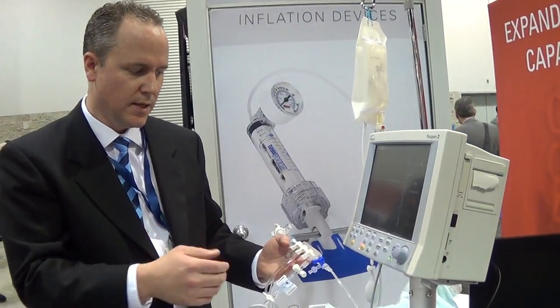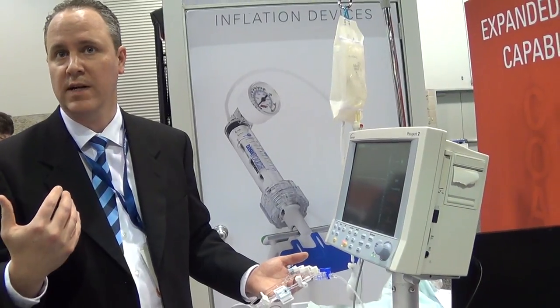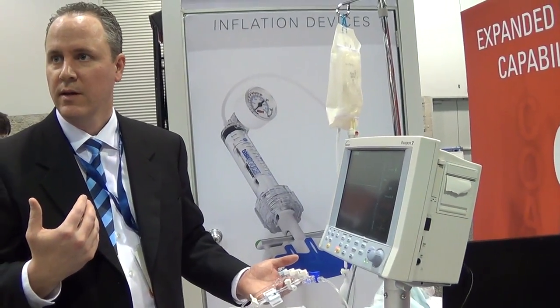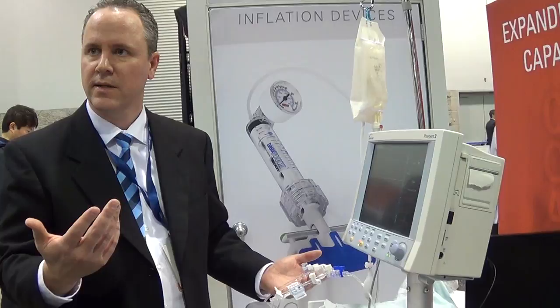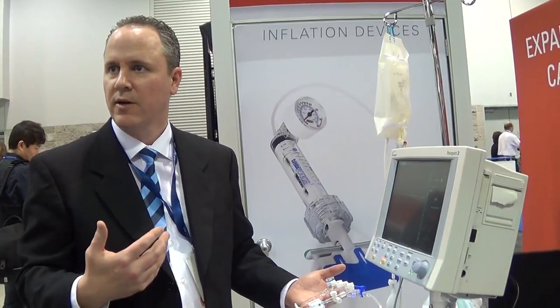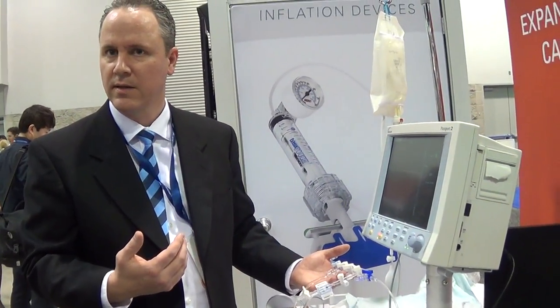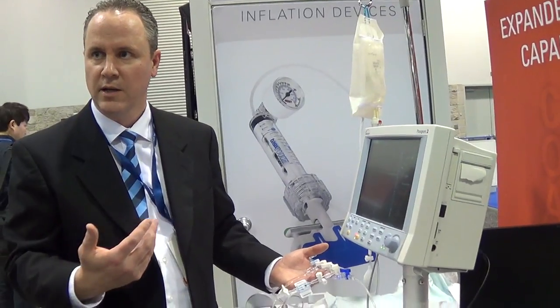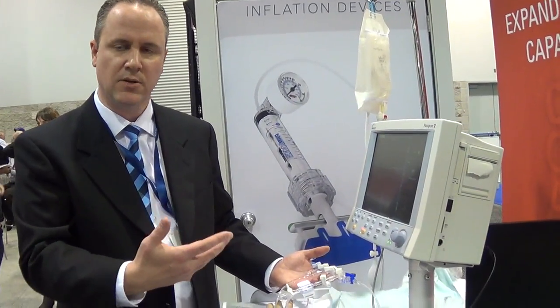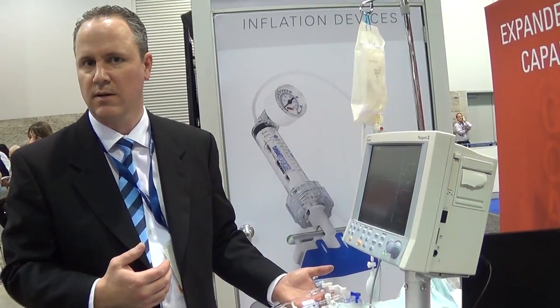The advantage we have at Merit Sensor is that we have a strong medical device company as our parent. We've worked with nurses who have worked in the field for 20 years and are now employed by our parent company. They've shown me and our engineering team that these types of scenarios are very common in the real-world environment, and we've been able to account for and design those into our blood pressure sensor element to withstand those harsh conditions.